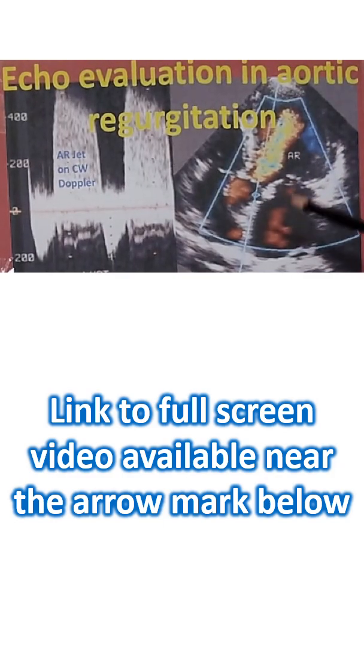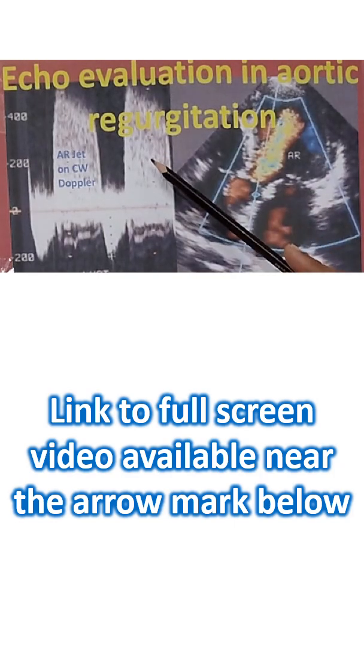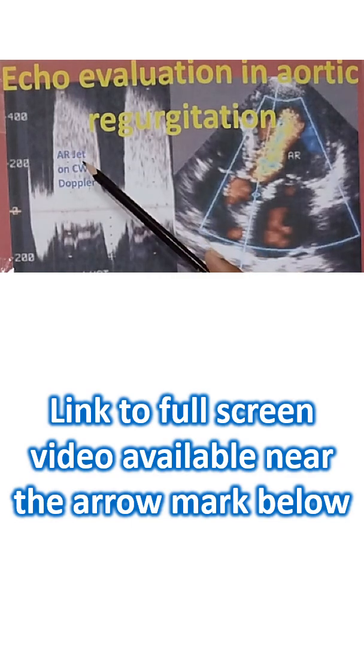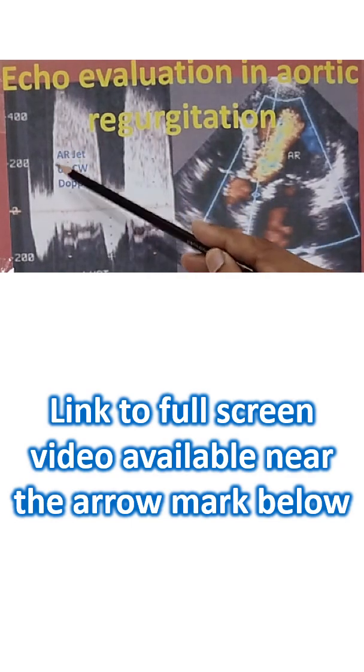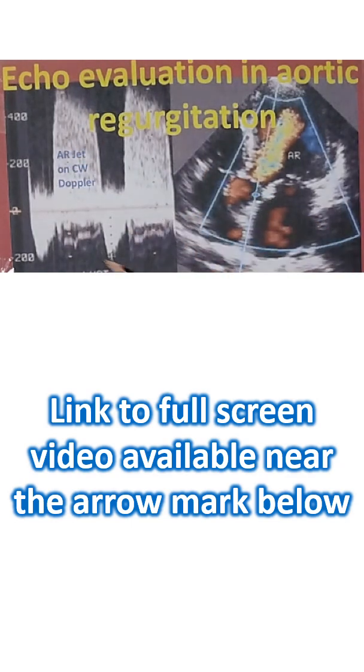The aorta is also taken as one chamber and this is the regurgitation jet into the left ventricle. You can see that the aortic valve is in closed position and the CW cursor has been placed here going through the jet. This is the forward velocity and this is the reverse flow, aortic regurgitation jet in diastole. This is systolic.